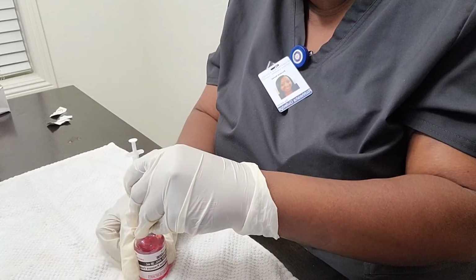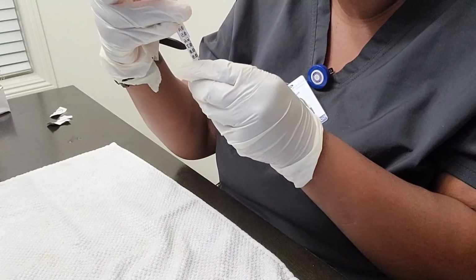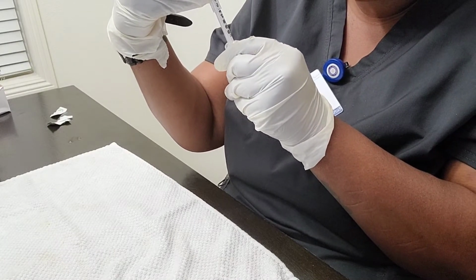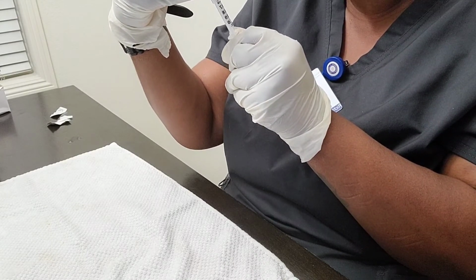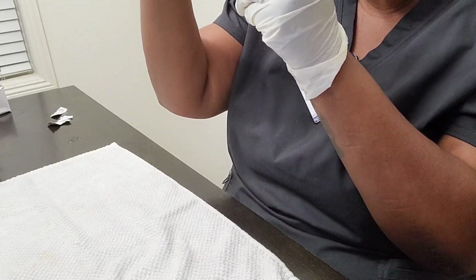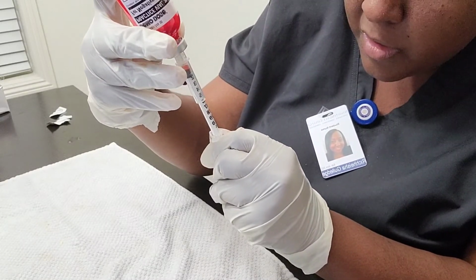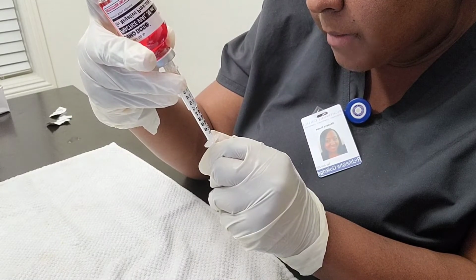And then I will flip over the vial, and I will get 0.1 ml of the medication. Oh, sorry. 0.1 ml. Here we go.